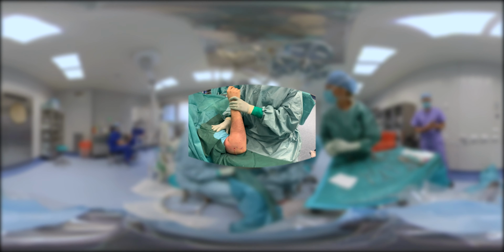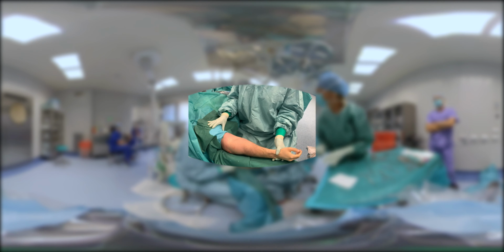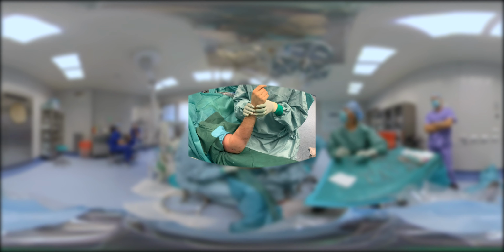At the end of arthroscopy, range of motion is assessed to confirm full restoration.